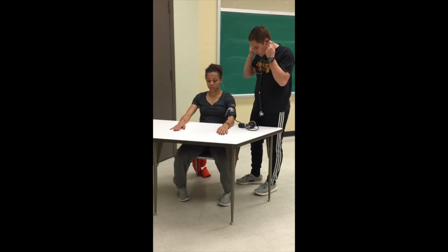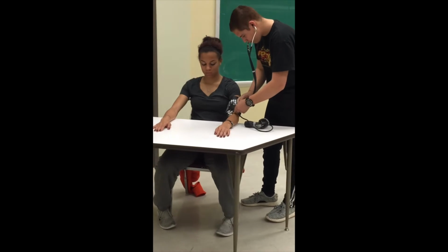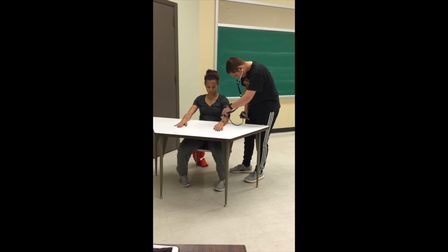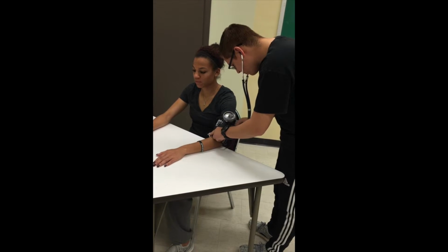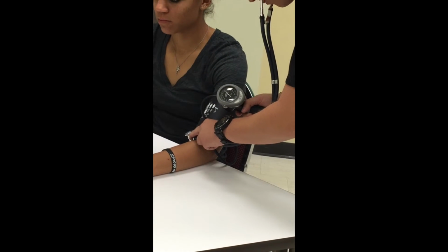Now place the diaphragm of the stethoscope at the brachial artery and pump the sphygmomanometer to about 160 to 180 millimeters of mercury, or 200 millimeters of mercury if needed. Once the cuff has reached 200 millimeters of mercury, release the air 2 to 5 millimeters of mercury per second.